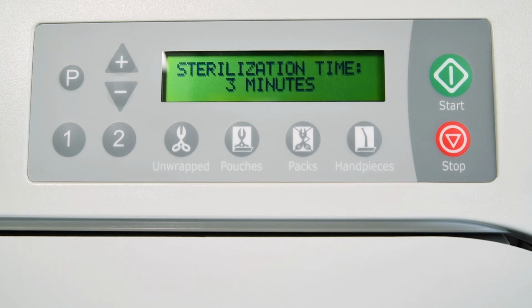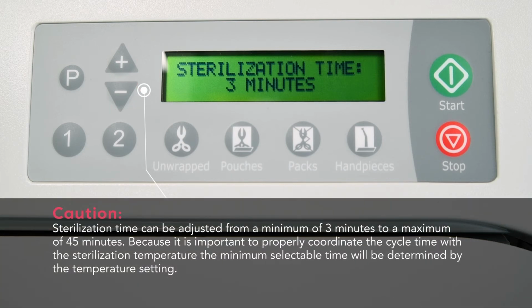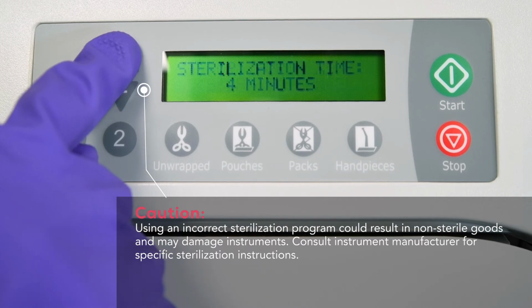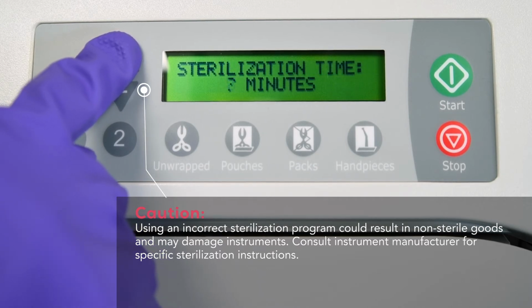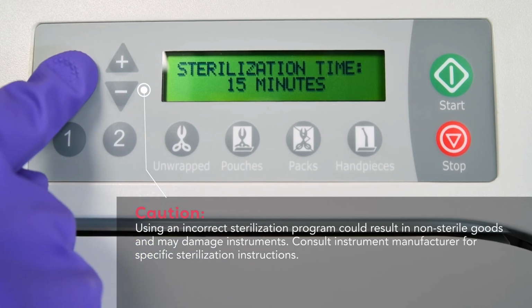After the sterilization temperature is set, the display will show sterilization time and the current value. Press plus or minus to adjust the time in 1-minute increments. Press P to continue programming the cycle, or stop to cancel. Using the plus or minus buttons, the sterilization time can be adjusted from 3 to 45 minutes. When the desired sterilization cycle time is reached, press P to store it.